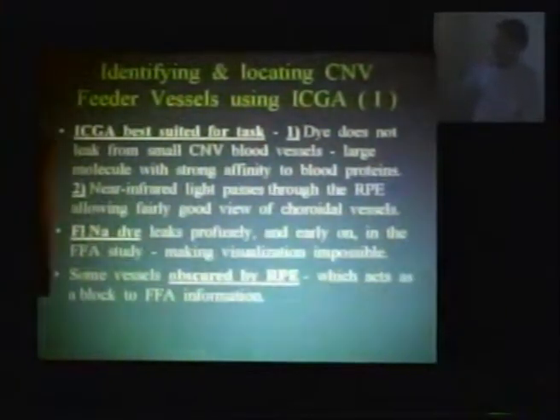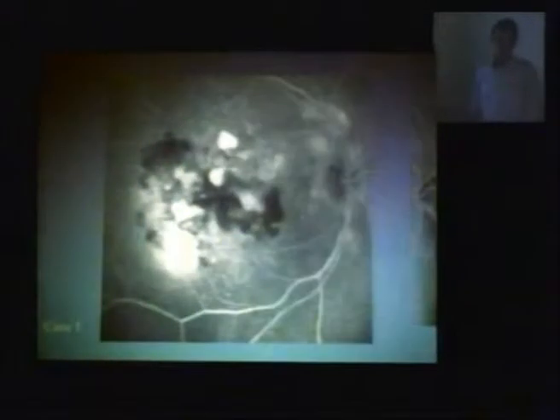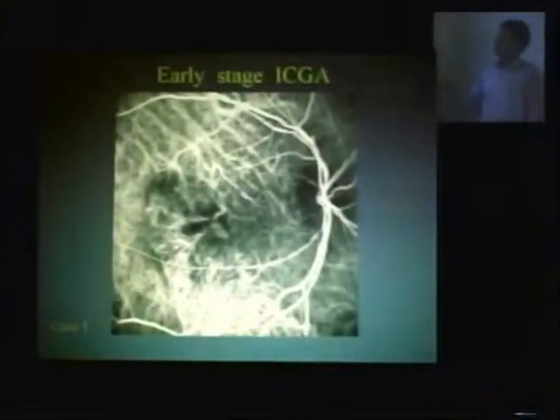Example. Okay, we have blood. We have AMD patient. Fluorescein. Early stage, pretty early stage. No details here. Late stage, even worse. Nothing to look for, no source. But if we do ICG, we see many details, early stage of the ICG vessels.